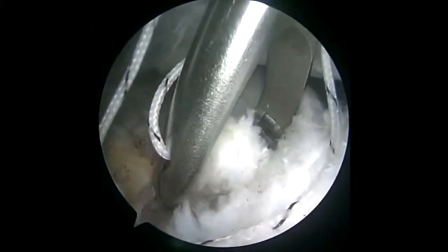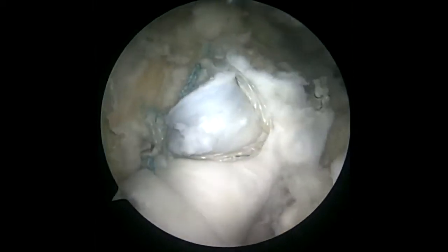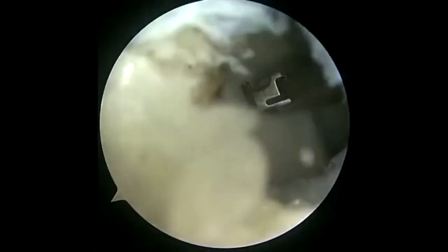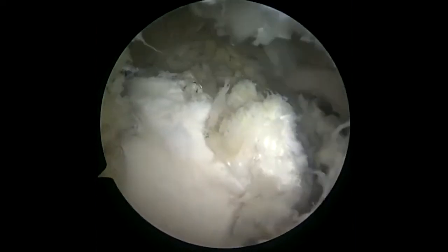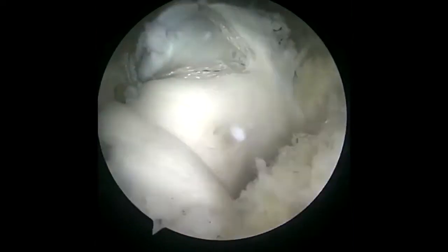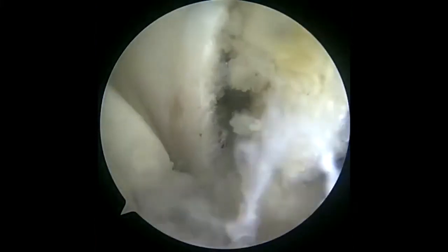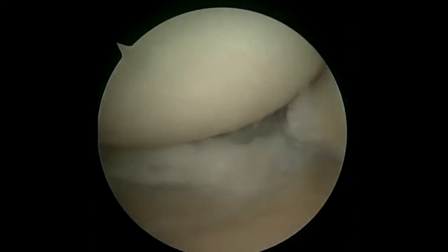Once the graft is secure in its place, the edge of the patch can also be attached to the subscapularis remnant with a simple stitch. The humerus can be gently moved to inspect tension and response to motion. Visualization of the glenohumeral joint final view shows that the anterior capsule is reconstructed and the procedure is complete.